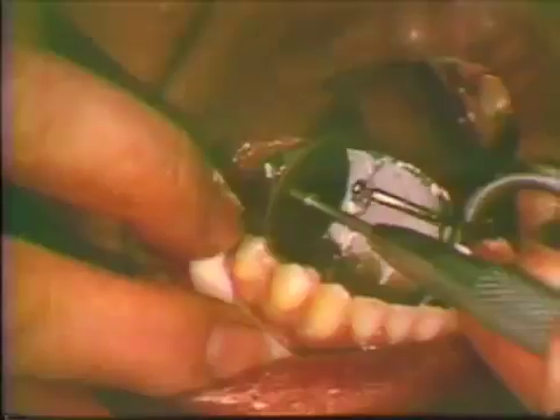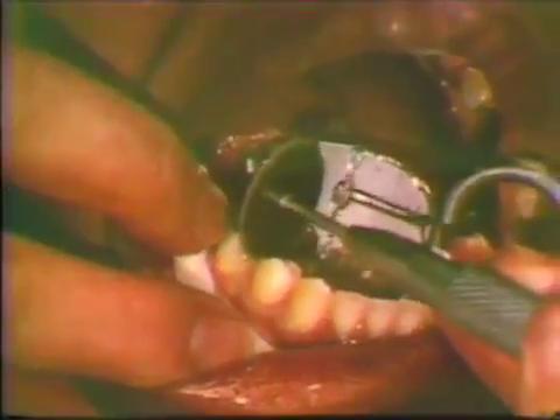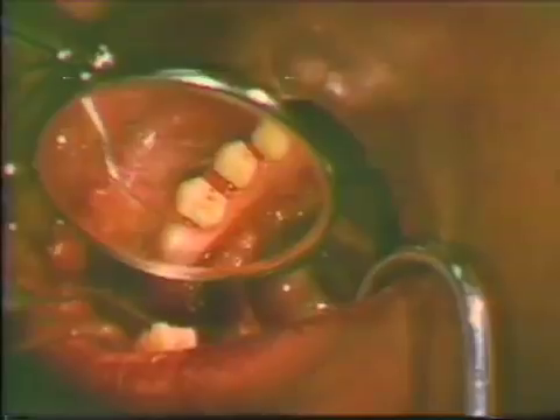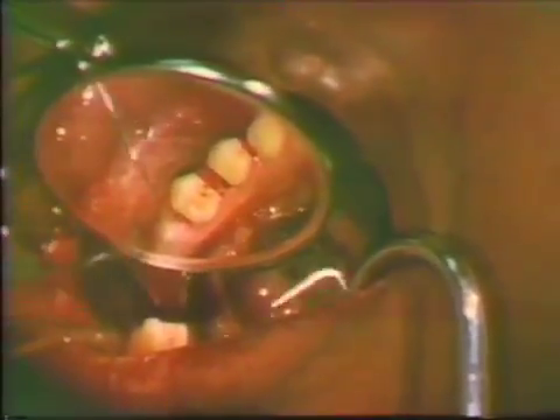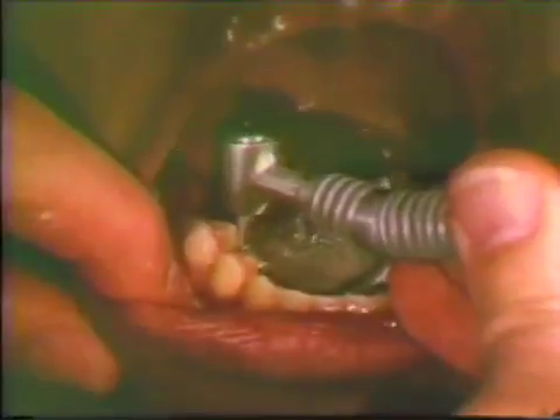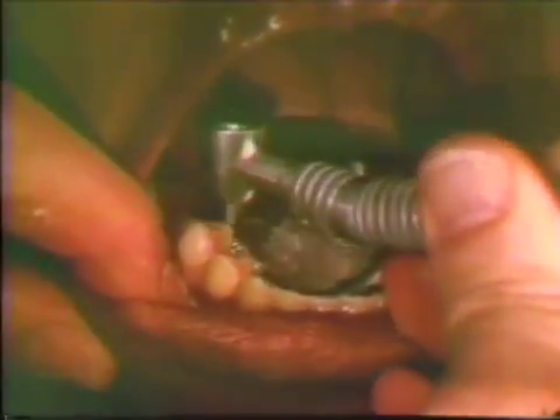The preparation of three-quarter crowns on adjacent bicuspids usually will begin with reduction of the proximal surfaces. Both teeth are prepared at the same sitting, and the preparations are so aligned that both crowns can be withdrawn or inserted as one unit. Short crowns require the proximal walls of the preparation to be as closely perpendicular and parallel as possible. Lingual surfaces are then reduced with a suitable diamond instrument, again maintaining the previously established parallelism.